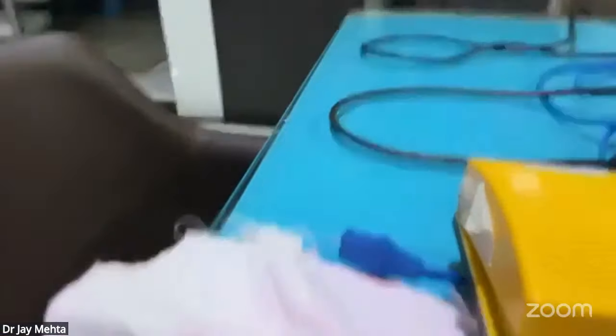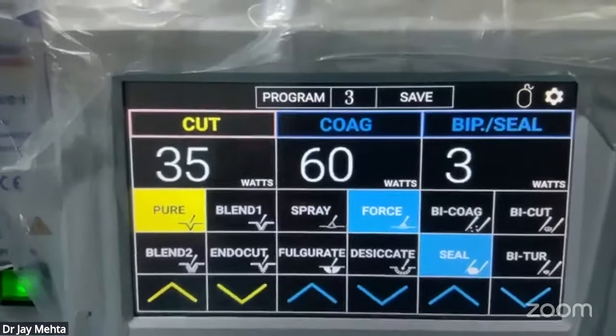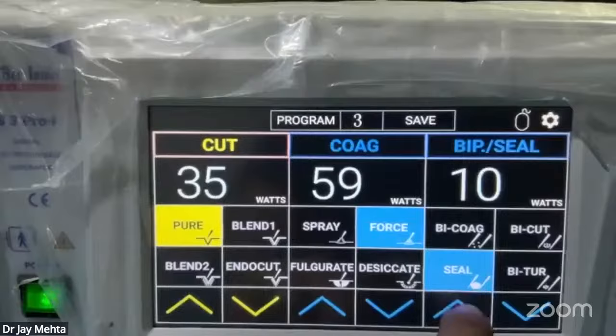The Shearer has very, very thin blades. So many people have asked me what the setting of the Shearer is. The setting which I have shown on this machine, as you are aware, is L3. See this, I have shown the setting at L3. This is 3. I can make it 4, I can make it 5, I can make it 6, 7, 8, 9, 10, whatever.